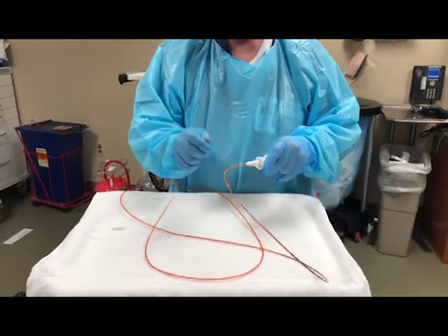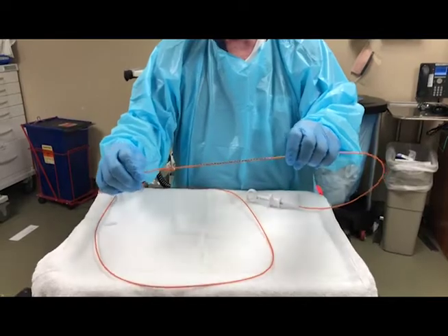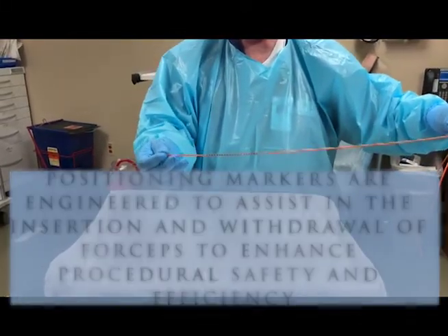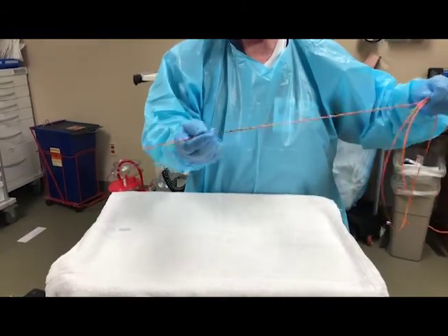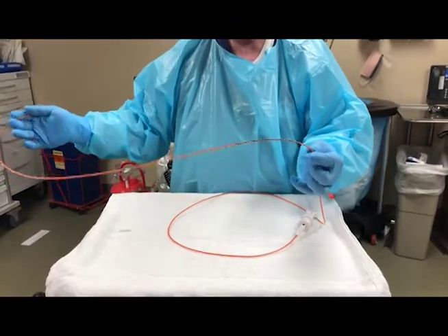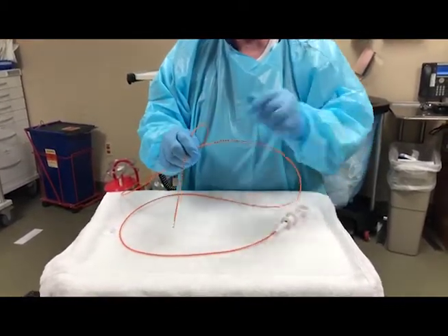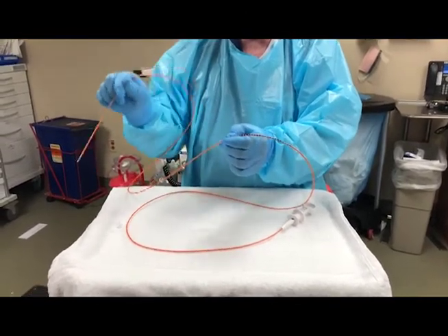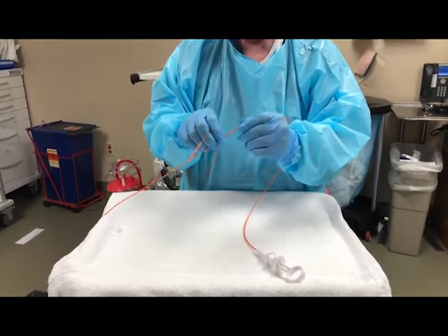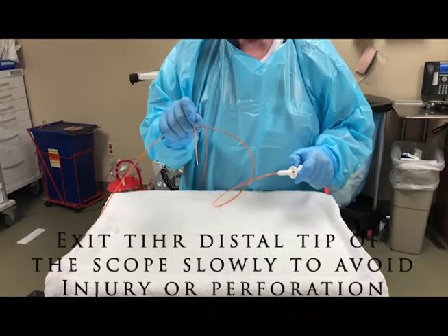Another interesting part of this are these graduation markers — some people call them in-and-out markers. There are three sets. The first set is about five to fifteen centimeters from the very end, and that helps you know when you're about to remove it from the scope. The next set is for gastroscopes, so you know when you're pushing the forcep into the working channel — when you start to get to those lines, you're nearing the end of the gastroscope. The next set of lines is for a colonoscope, so as you're pushing down the working channel, when you start to see these lines you'll know you're close to exiting the tip of the scope.